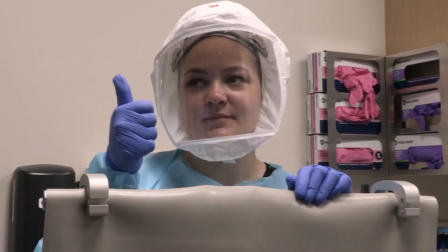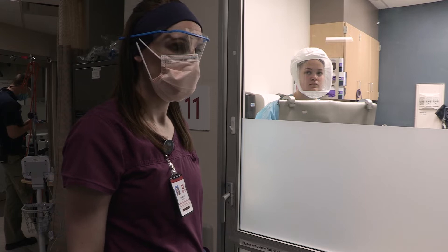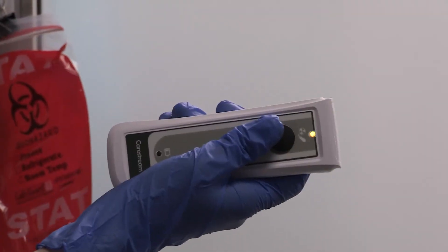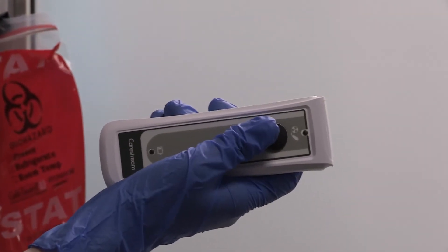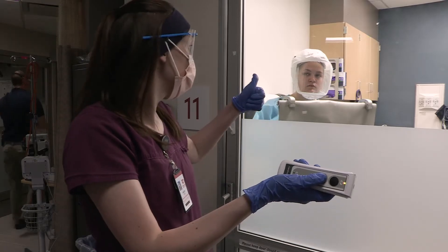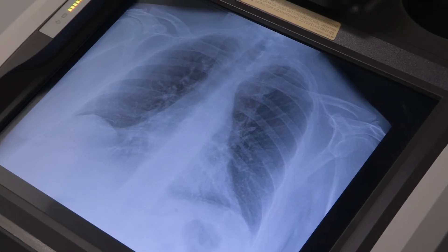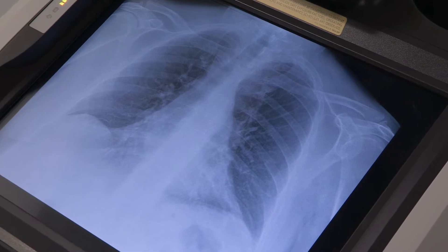The nurse will signal to the technologist when the patient has taken a deep breath. The technologist will also watch the patient's breathing, look for the nurse's cue, and then take the x-ray, after which the technologist will gesture that the image is taken and the nurse can tell the patient to breathe normally. The technologist will evaluate the image on the x-ray machine for diagnostic quality.